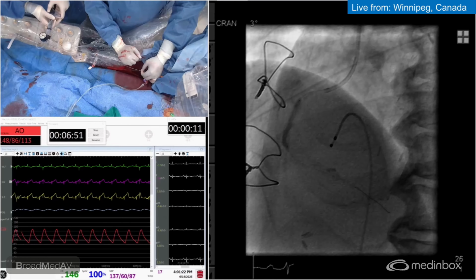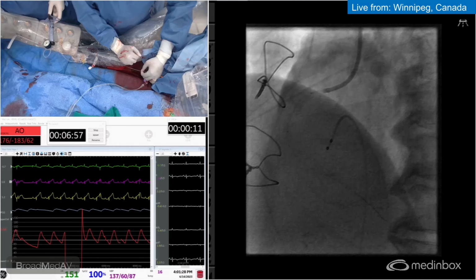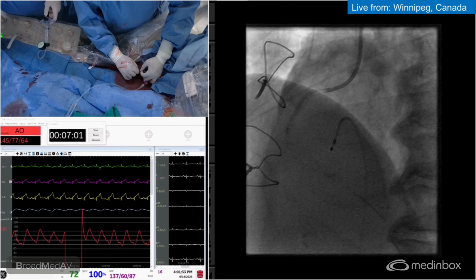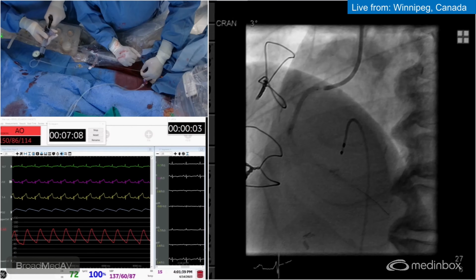Good. Let's make sure it's off there. I'll hit that part too. Oh yeah, that looks pretty good. I think it looks great. All right, let's take this out.